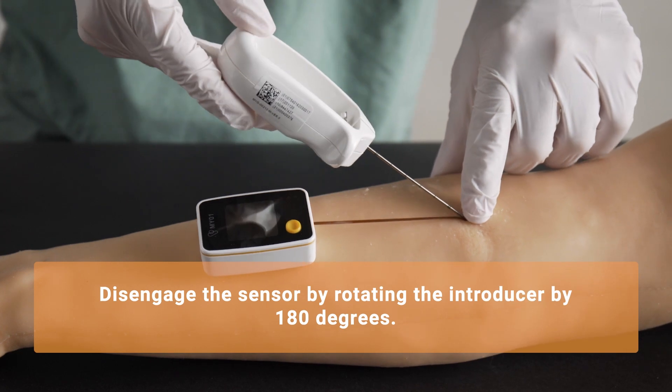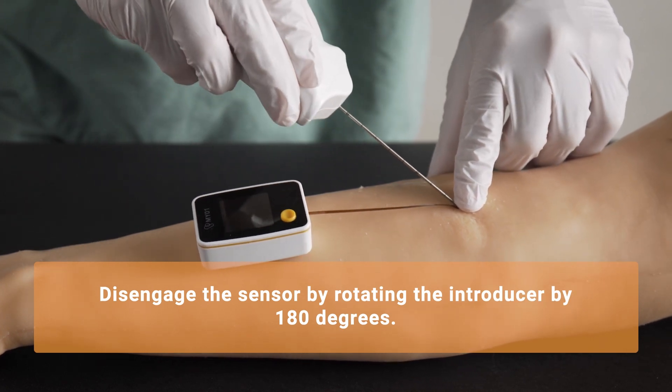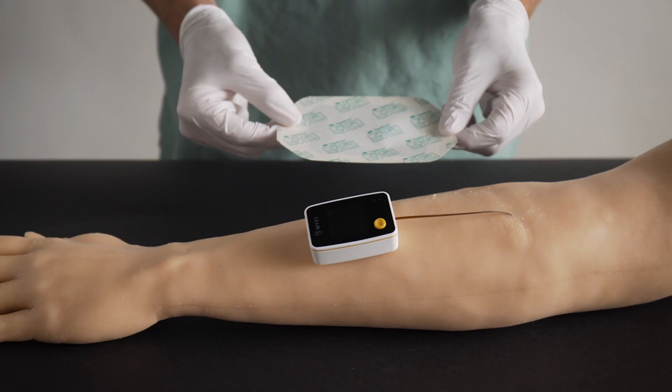Place your finger on the insertion site and rotate the needle introducer 180 degrees, clockwise or counterclockwise. Then, explant the needle introducer.